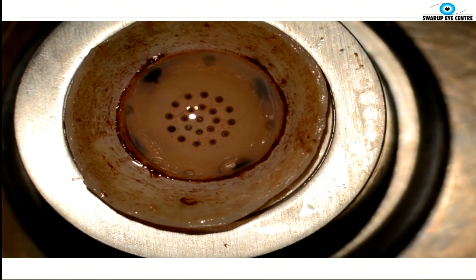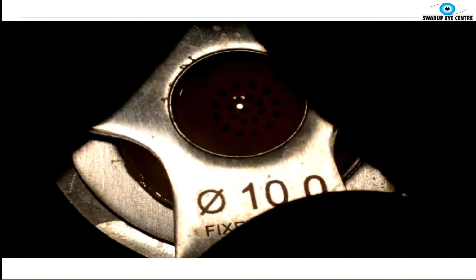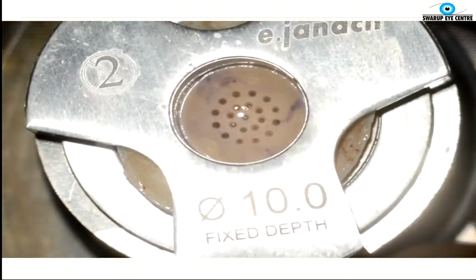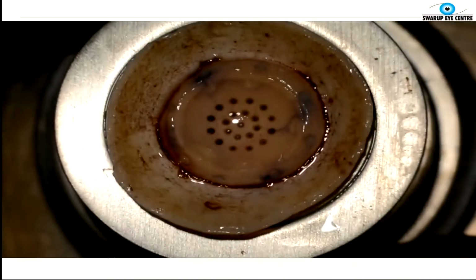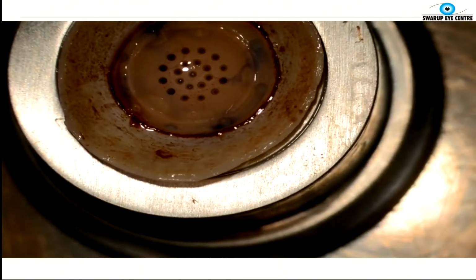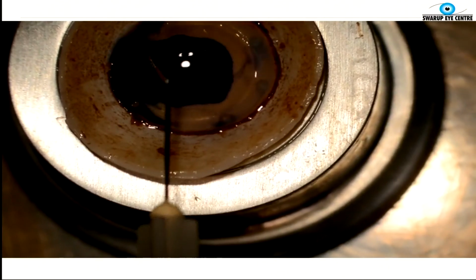Then you invert the graft. It's a good idea to first make an initial trephination of a large diameter. In this case, I'm using a 10 millimeter. One could also just score the peripheral Descemet's membrane to cut it. The idea of this trephination is just to get a peripheral cut from where you can start stripping the Descemet's. So you can even use any sharp or semi-sharp instrument to just score all around and then start stripping.